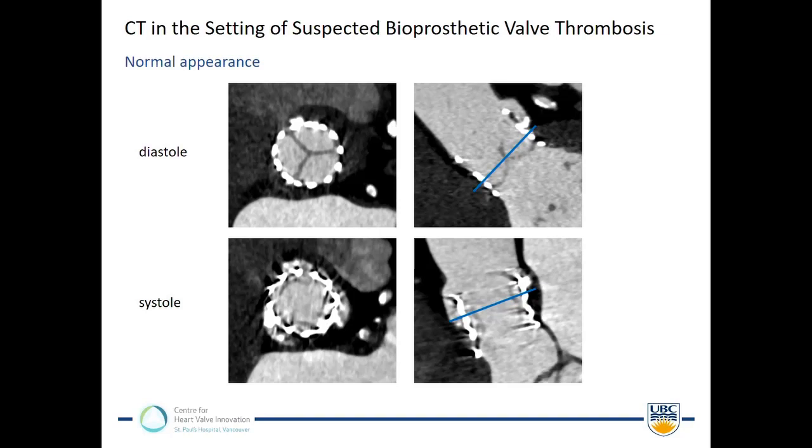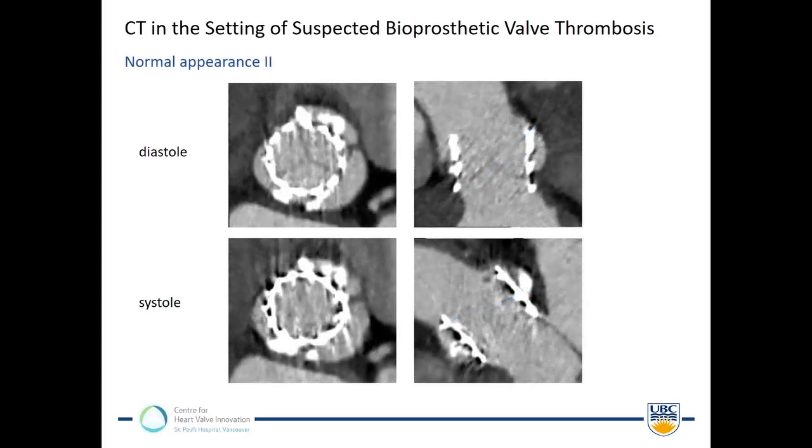Those leaflets should have symmetric appearance, and you see in the upper right-hand image the leaflets are depicted in a very faint but symmetric fashion. Upper images in diastole, nice visualization of the leaflets. In systole, you have more artifacts, obviously, depending on your scanner type and the phase you choose. In this scenario, you can actually see the leaflets in systole opening in a symmetric fashion, almost in line with the stent frame. A second set of images, different patient, different CT scanner.